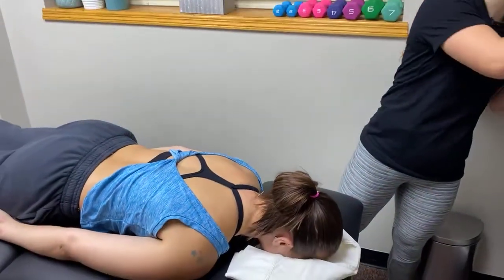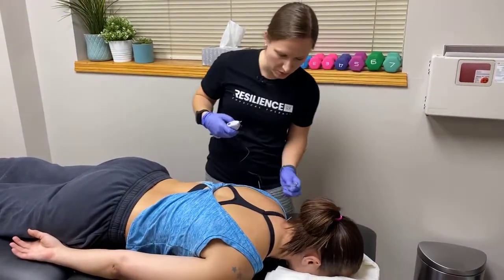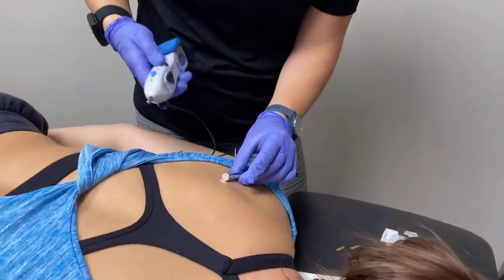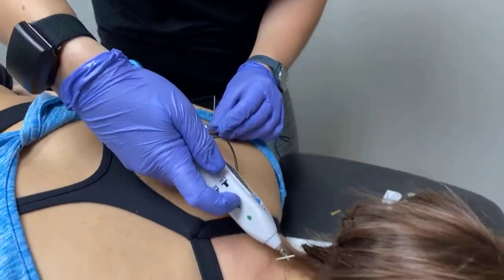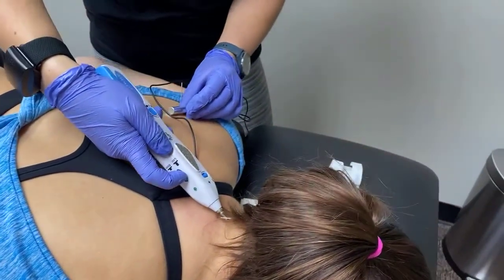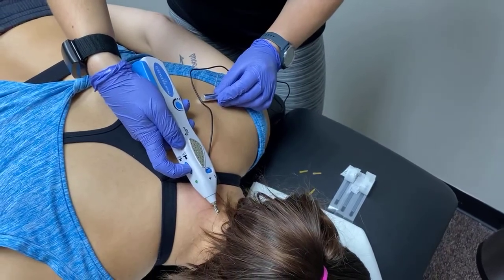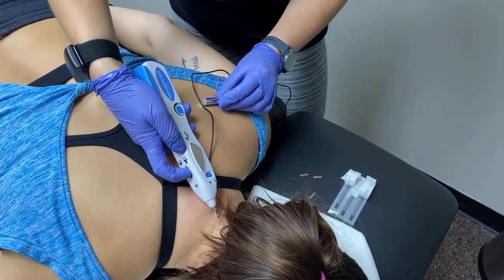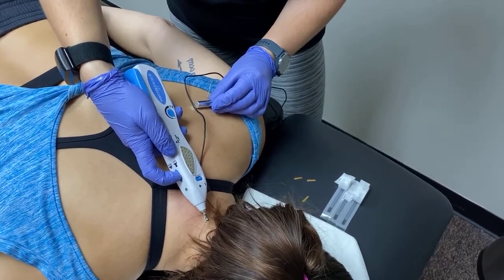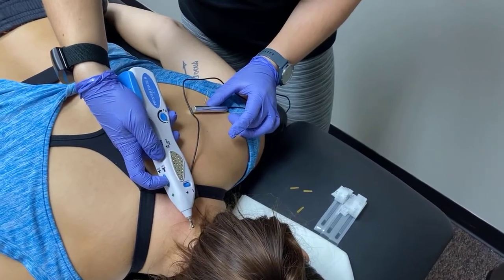So then what we'll do is we'll take a TENS unit. This is one of them. We will attach it or make it touch both of these points out here and here. So I'll turn the E-stim on. I'll slowly increase the intensity. Let me know when you start to feel it. Okay. More in the shoulder or more in the neck? More in the shoulder. Okay.